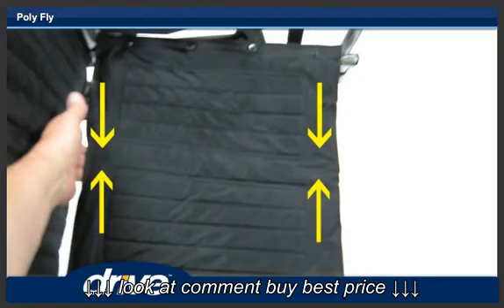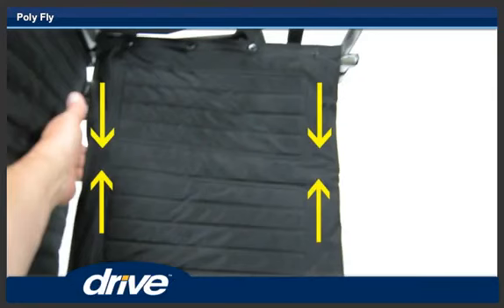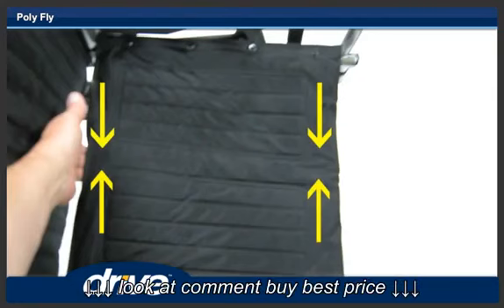Step 4. To fold the chair, lift up on the center of the seat upholstery at the front and back.